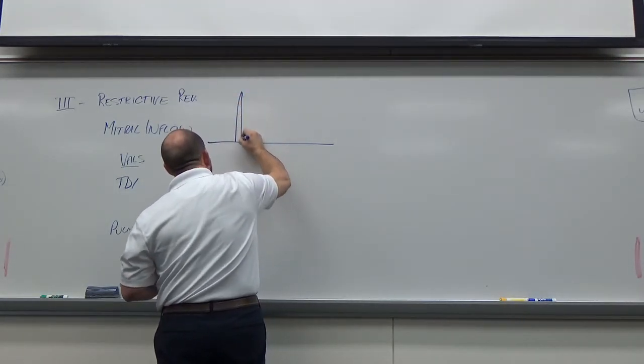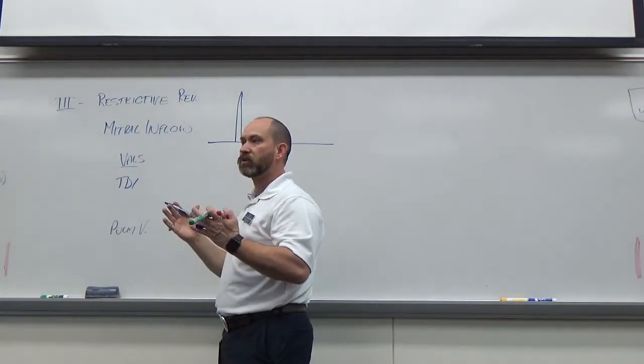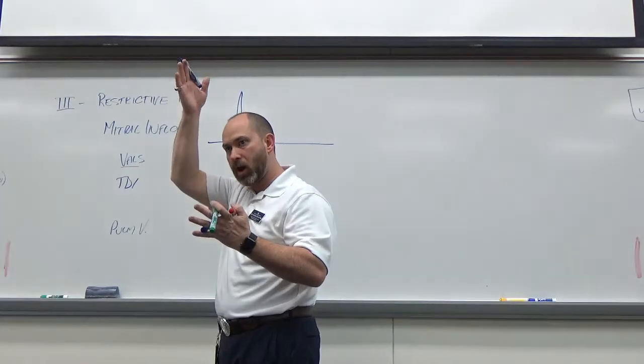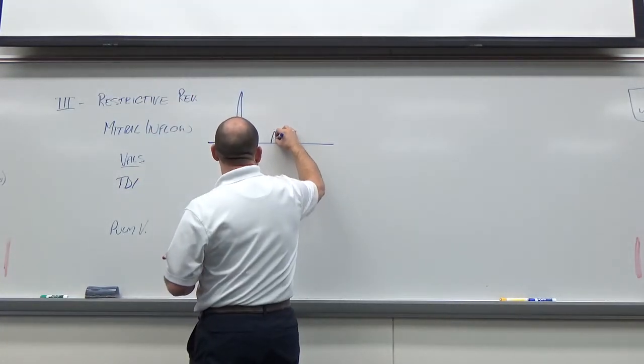Now the decel time we talked about before was pretty much normal decel times. Now my decel time is getting less. It's dropping off super quick. So I'm going to get a relationship more like this.